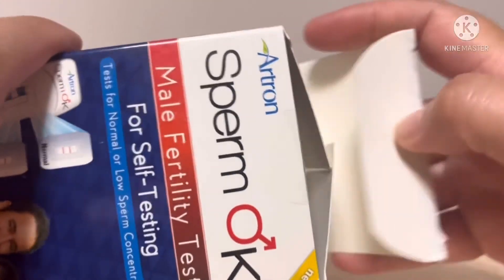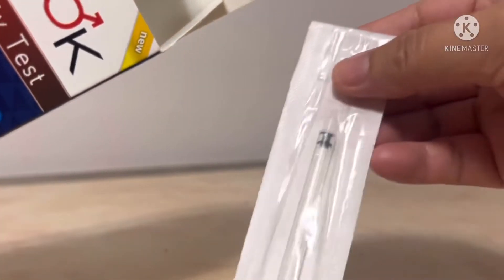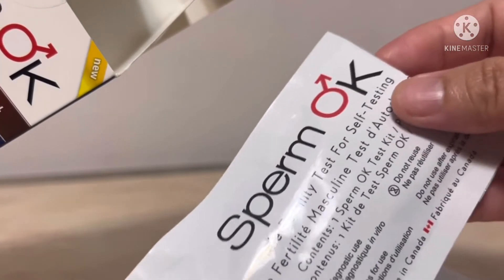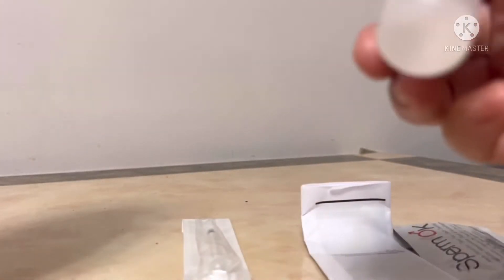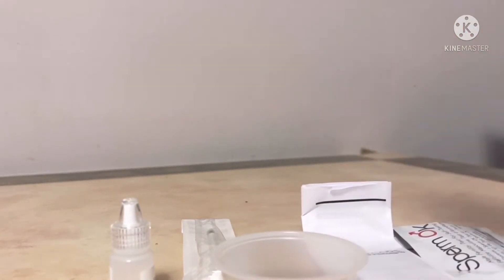So inside there is an instruction sheet, a plunger, the kit which you can put the specimens on, the instruction for use, and the solution. Everything is sterile.